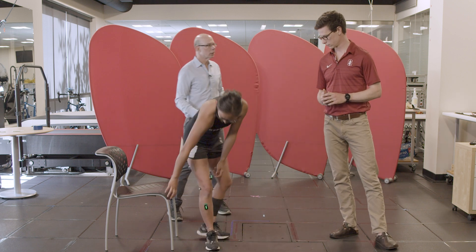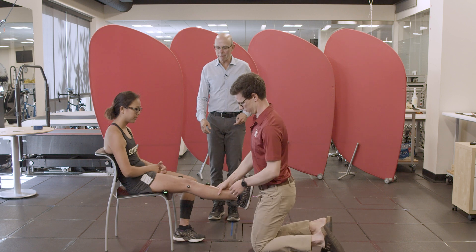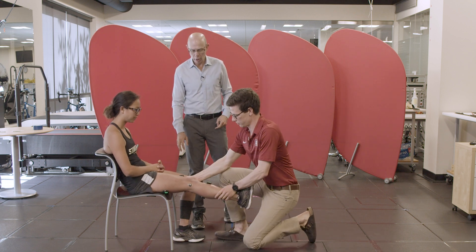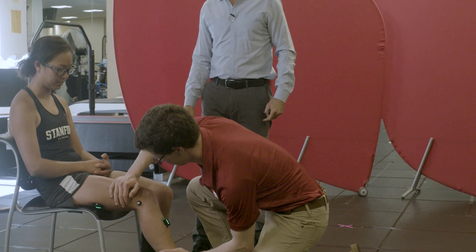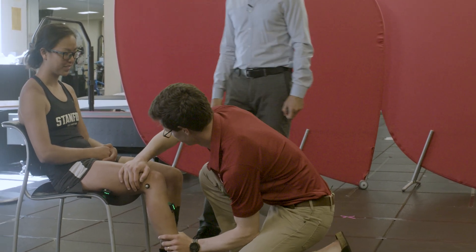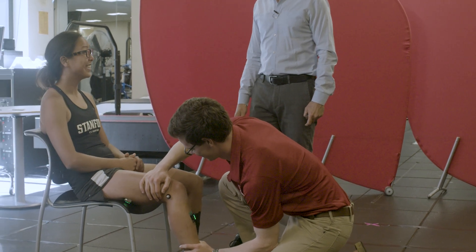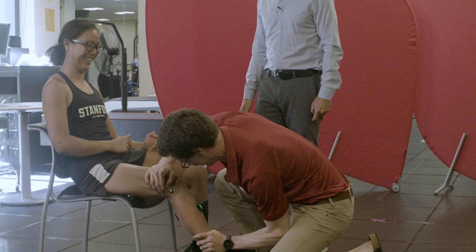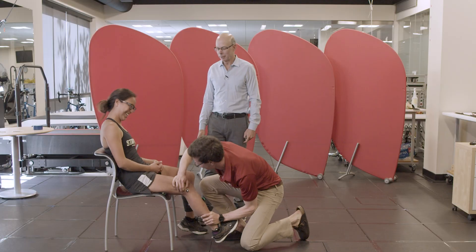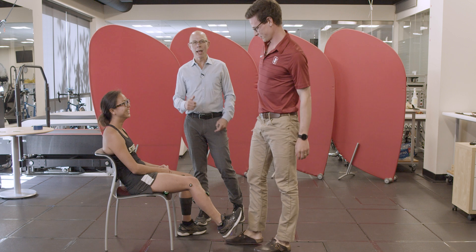So we're going to have Hannah do a maximum contraction of her quadriceps. Scott will resist while she extends her knee. We'll encourage her to ensure we get a maximum contraction. She performs the contraction, and we got a maximum contraction — we'll use that as the one, the maximum.